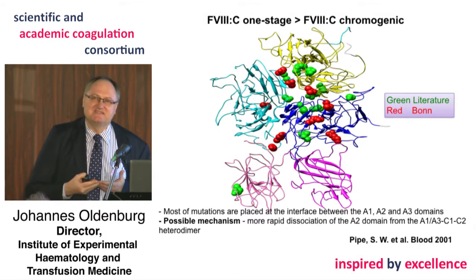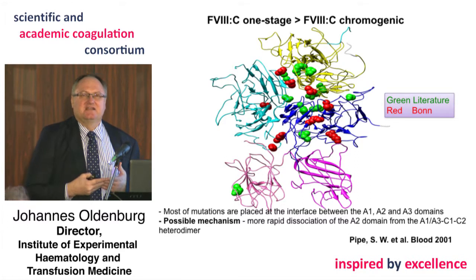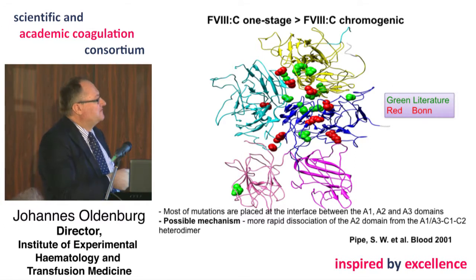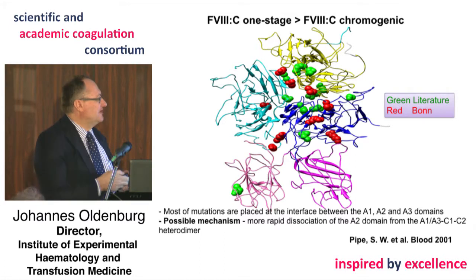And the hypothesis is that the high dilution of the factor VIII in the chromogenic assay and the incubation time facilitates the dissociation of the factor VIII domains, so that the chromogenic assay is showing a lower activity than the one-stage assay.